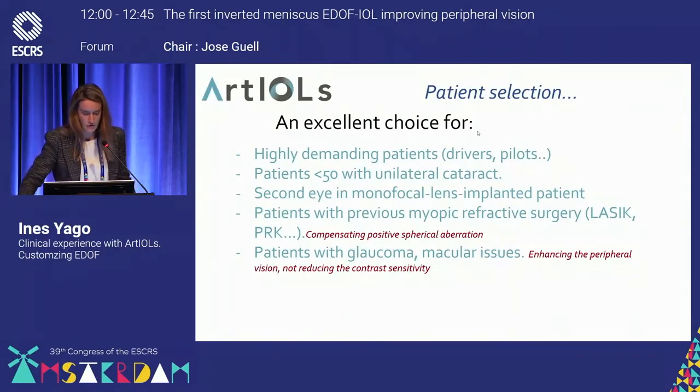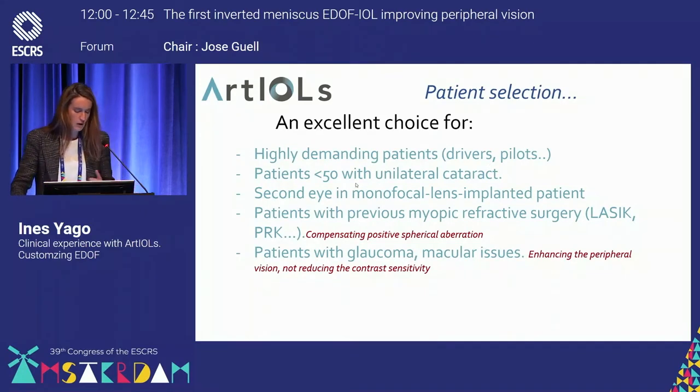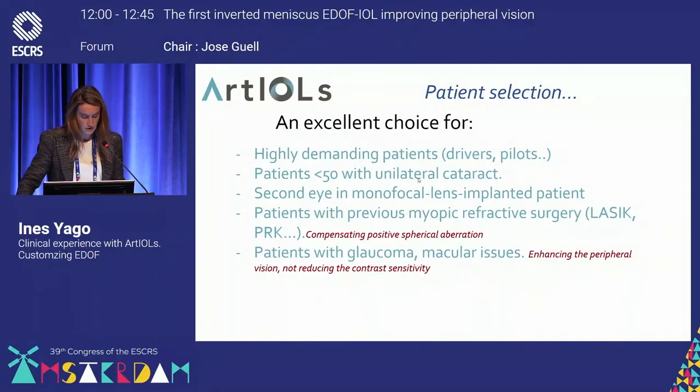As Pablo has said before, I think this is a good option almost for everyone, but I would suggest these implants in these particular groups of patients. All those highly demanding patients that want to have really good far and intermediate vision without light side effects like drivers or pilots, maybe young patients with unilateral cataract. The second eye in a monofocal lens implanted patient could also, in that way, we are improving the intermediate vision.